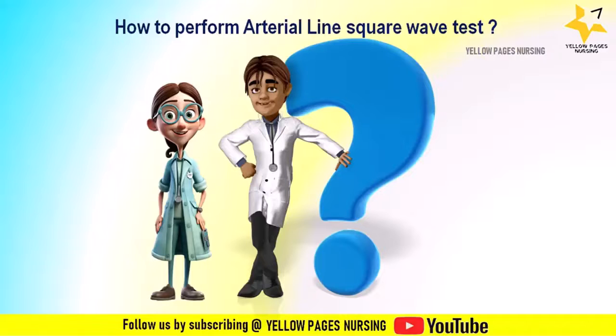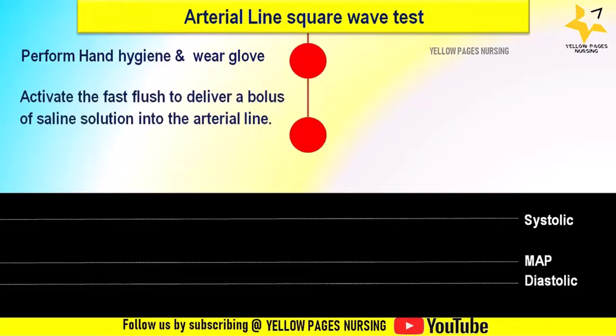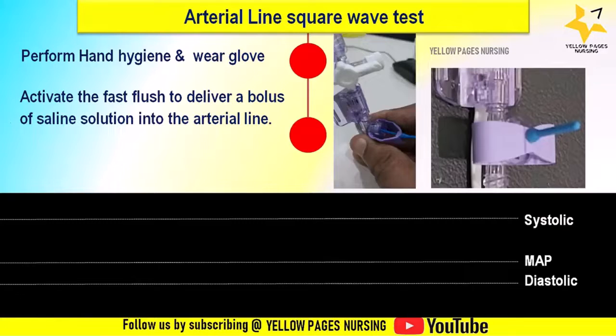Perform hand hygiene and wear gloves. Next, activate the fast flush to deliver a bolus of saline solution into the arterial line. This can be done by squeezing the fast flush with 2 fingers as shown in the figure, or rapidly flush the line with normal saline using a syringe. This causes a sudden increase in pressure within the system. Now observe the pressure waveform.